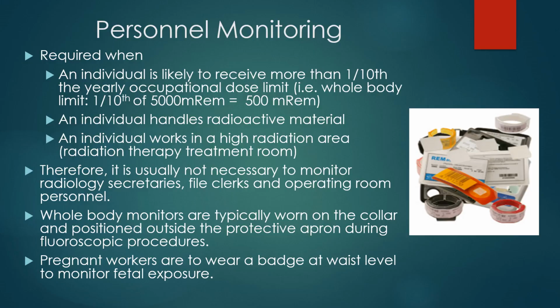Monitors are typically worn at the collar and positioned outside of the protective apron during fluoroscopy procedures. Pregnant workers are to wear the badge at waist level to monitor fetal exposure. Be sure to know your local regulations and consult with your medical physicist regarding monitor use.